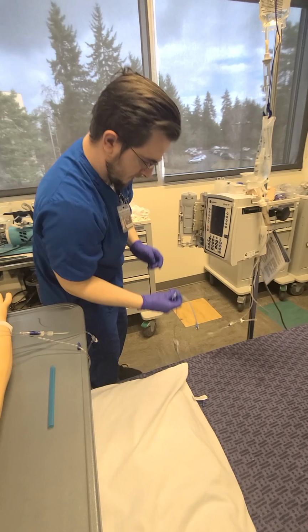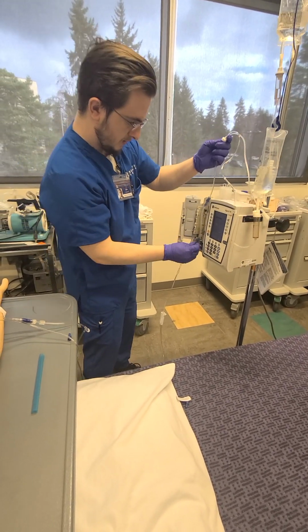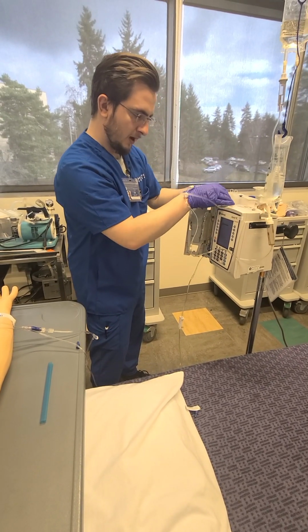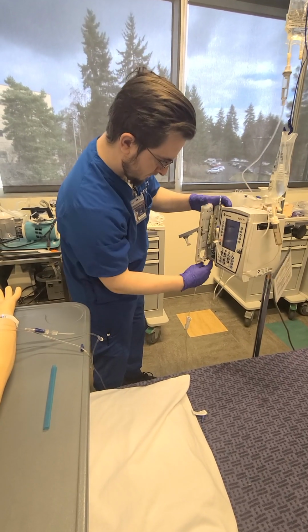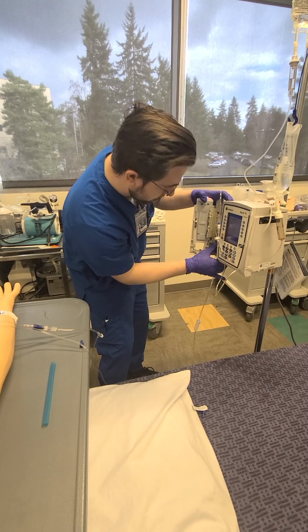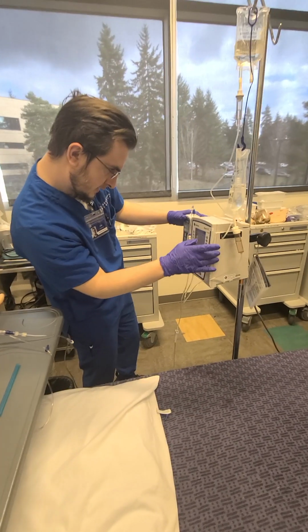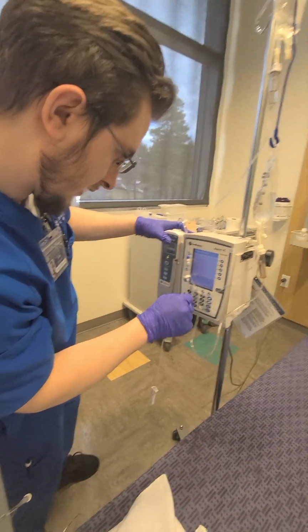I'd go check again just to make sure in the MAR, but it is 125 milliliters an hour for my primary, which is normal saline. Patient ID, this would be the ID for Erica.